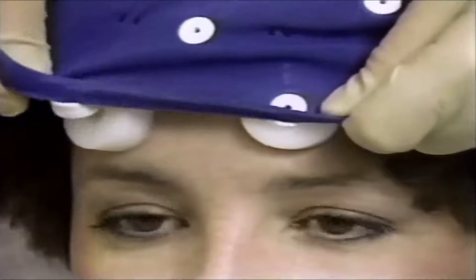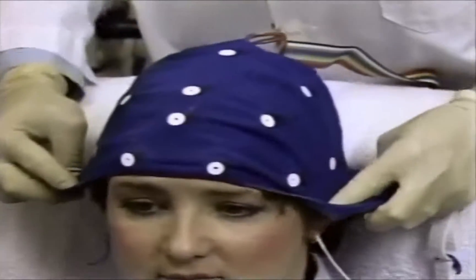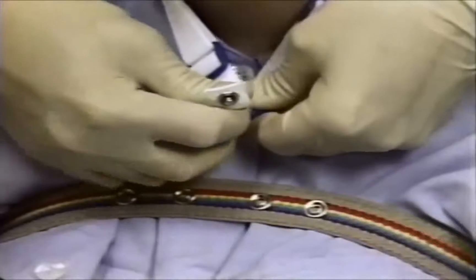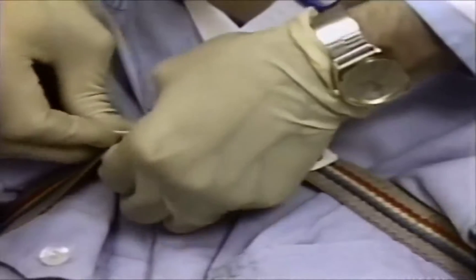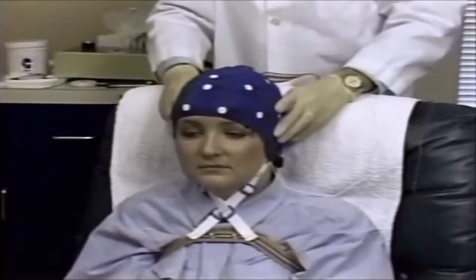Continue to work the cap on from front to back until it is tight on the head. Secure the cap straps to the body harness by crisscrossing the straps and snapping them into place. Double-check that the straps have been pulled tightly and secured, as this will reduce movement artifacts during the EEG exam.